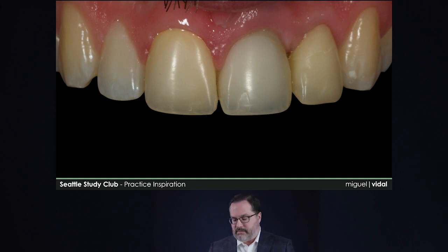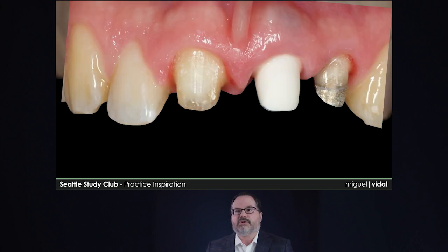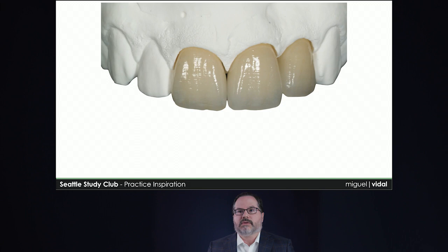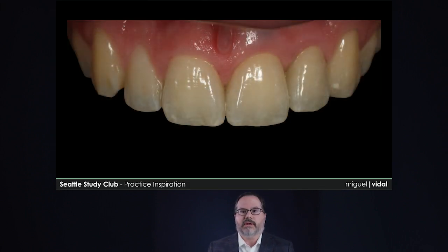So once we're ready to make our impression, we go ahead and design our abutment with whatever material we want, and we make it to support the soft tissue that we've created and to mimic also the natural tooth preparation on tooth number 8 for more symmetry with the crowns. Then we turn it over to our technician, and they go ahead and fabricate our 3 ceramic crowns, and then we can rehabilitate this patient from his trauma scenario to the 3 teeth in the area.